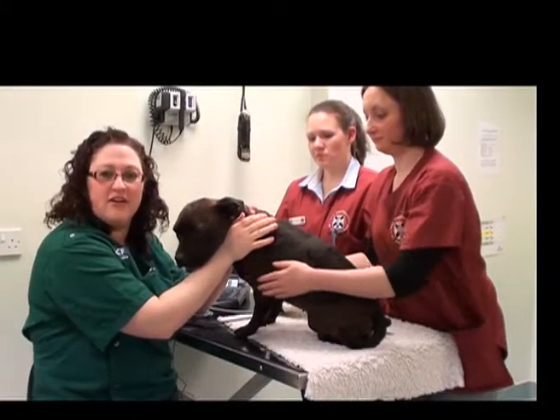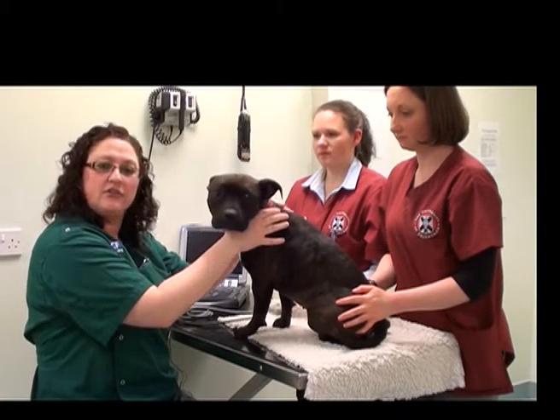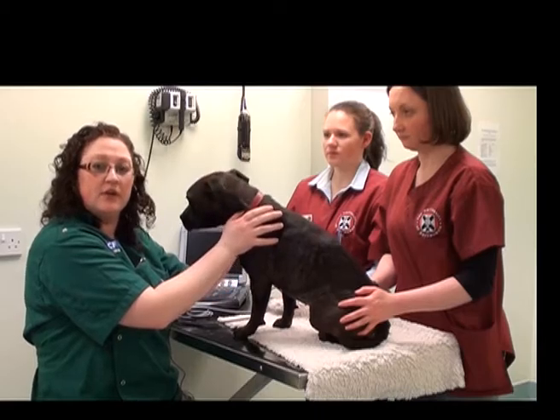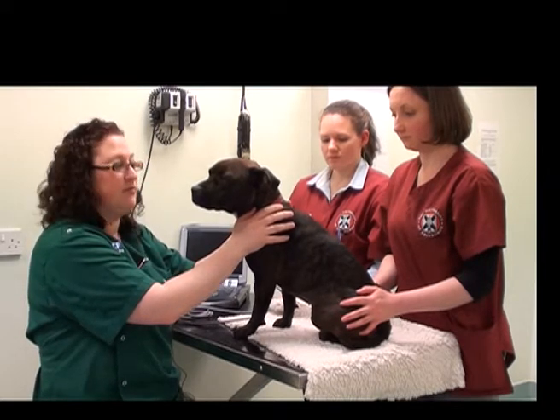So now we've completed our abdominal ultrasound exam. What we would also do is flip the patient over and actually look at the other kidney, or especially in a large dog, possibly the other side of the liver as well, or other organs that, especially in a deep-chested dog, we weren't able to see from the right lateral recumbency.